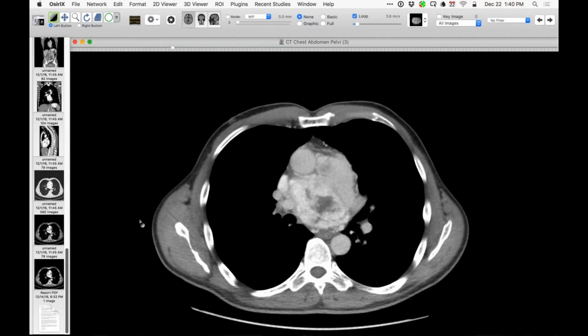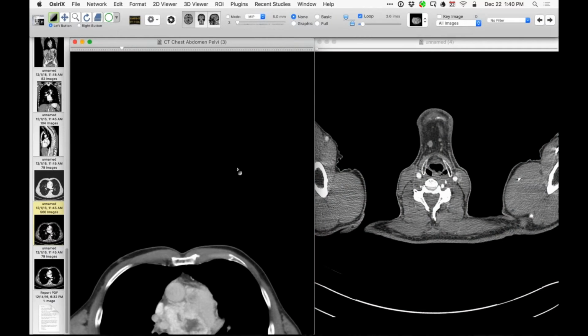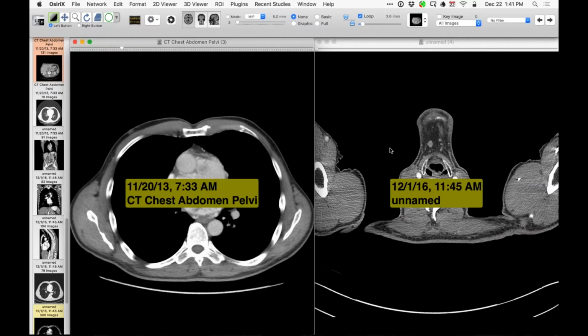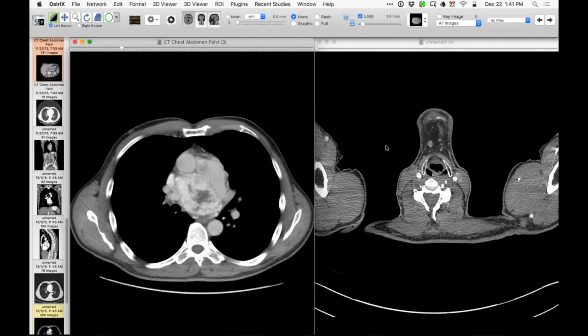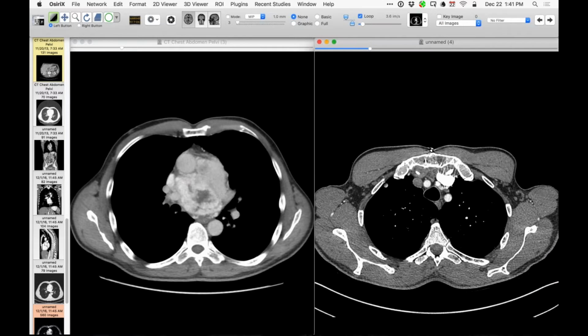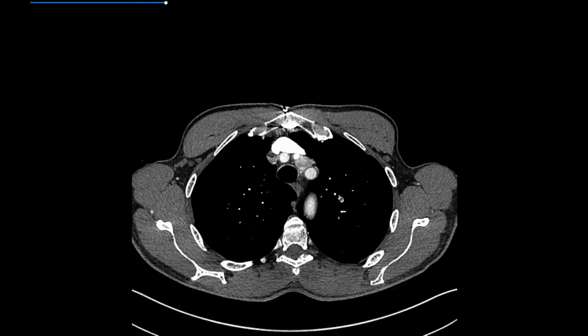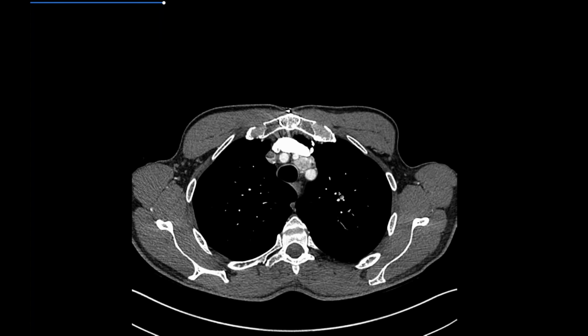And he comes into the clinic and he gets imaged in clinic visits at intervals. And he's doing okay. But unfortunately, with the most recent visit that I read, I can see recurrence of it. So the time interval here is 3 years. Full 3 years have gone by. And oops, right here, unfortunately, it has come back. It's not very big, but given what it looked like before and what I see here, I was pretty confident in diagnosing recurrent paraganglioma right there, just between the subclavian and the carotid.